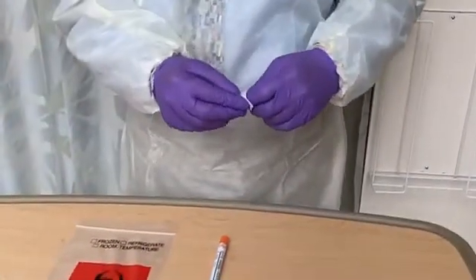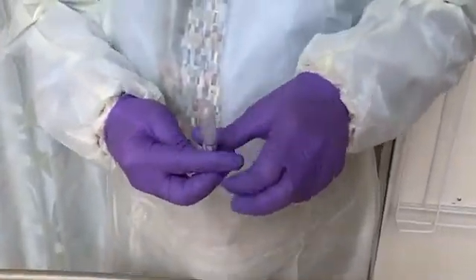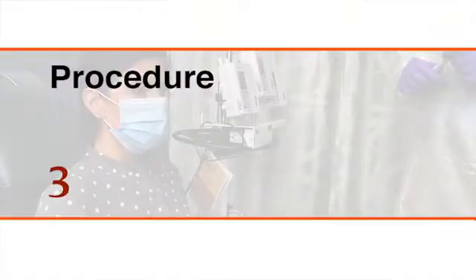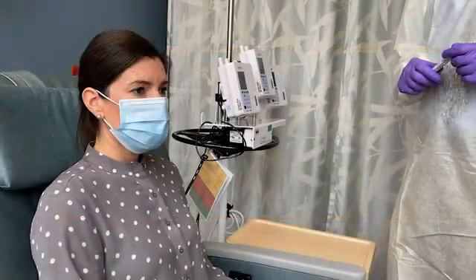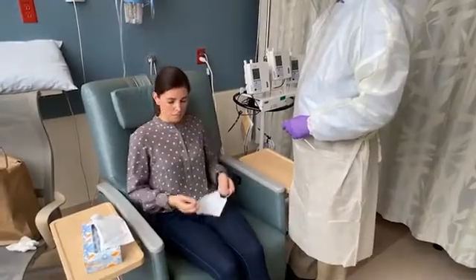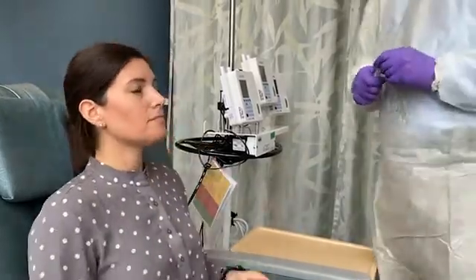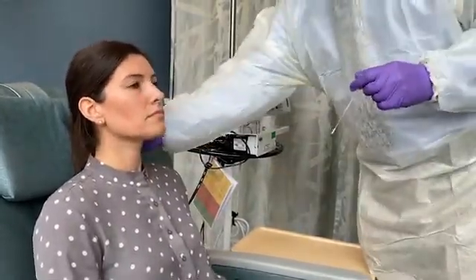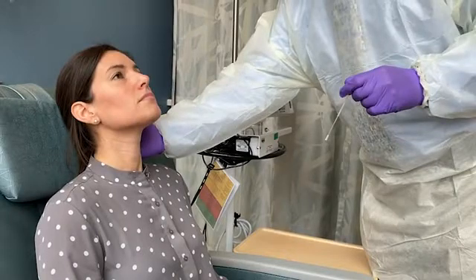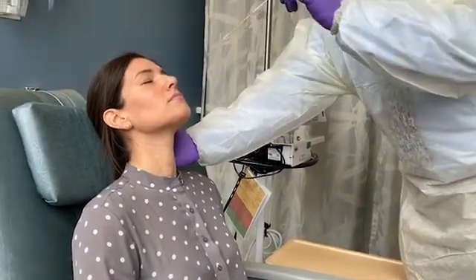All sample tubes should be labeled and the appropriate requisition forms filled out before starting the procedure. Masks are recommended for all patients suspected of having COVID-19. Have the patient take off her mask and blow her nose into a tissue to clear excess secretions from the nasal passages. Remove the swab from the packaging. Tilt the patient's head back slightly so that the nasal passages become more accessible.